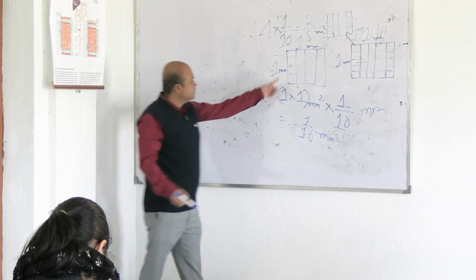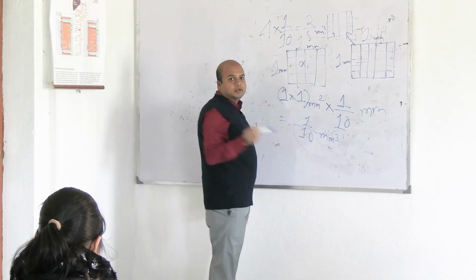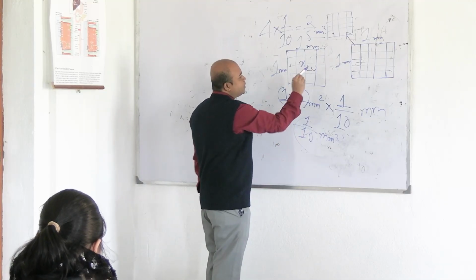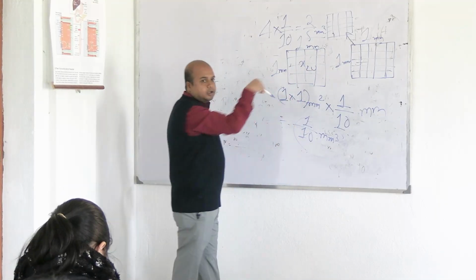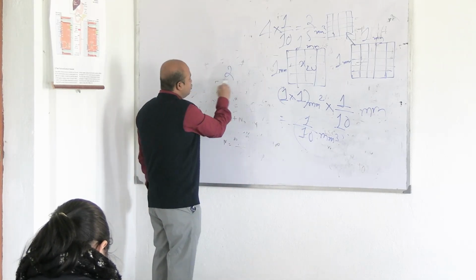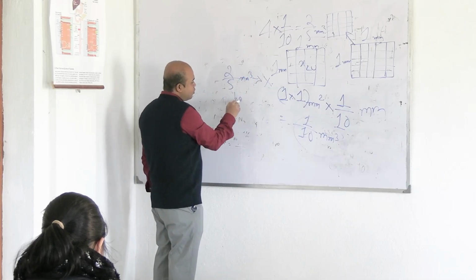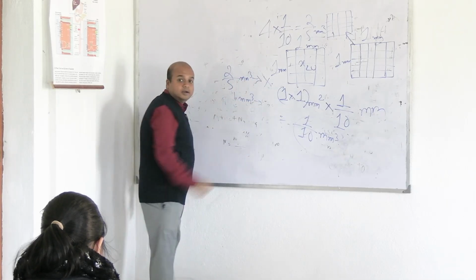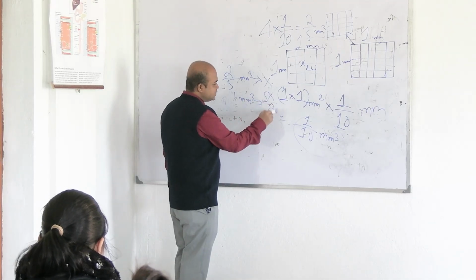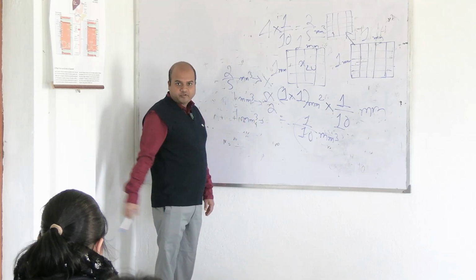We are counting cells. Say this is the left upper WBC square, we will name this x1. x1 is equal to, or x in left upper is equal to so many cells. Then capital X is x1 plus x2 plus x3 plus x4. So that 2/5 millimeter cube contains x number of WBCs. So 1 millimeter cube, but this is diluted blood. This is 5x/2 number of cells in diluted blood. So for undiluted blood, this is multiplied by the dilution factor.